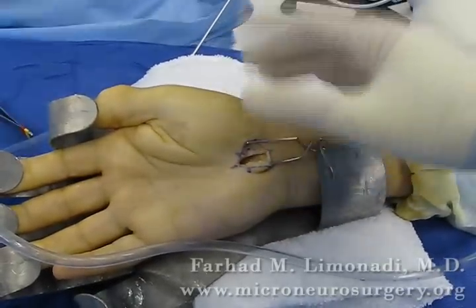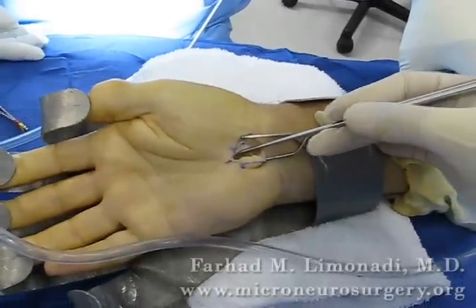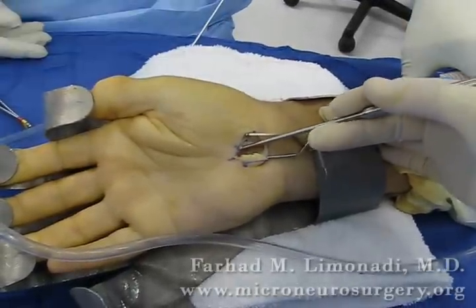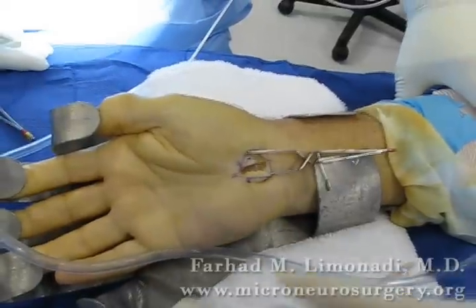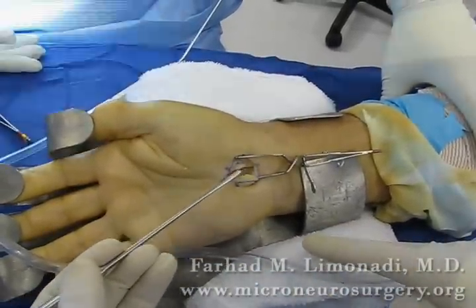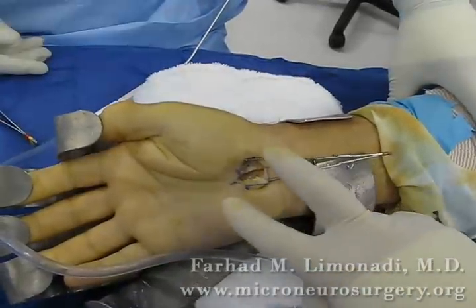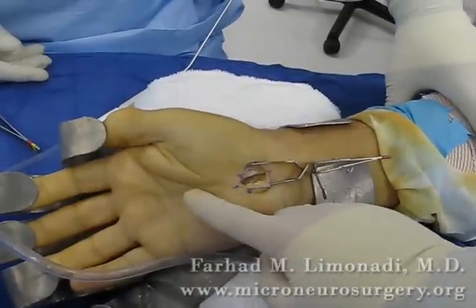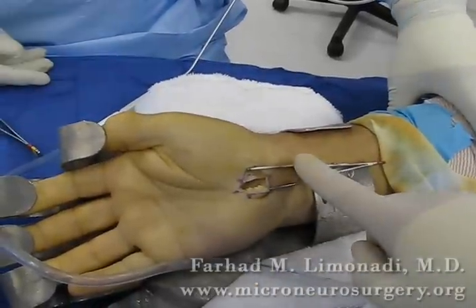We were able to release the transverse carpal ligament from all the way here, where you can see, free, to here — all freed up underneath. So our incision is only this much, but we were able to free the transverse carpal ligament over an inch distally and an inch proximally.